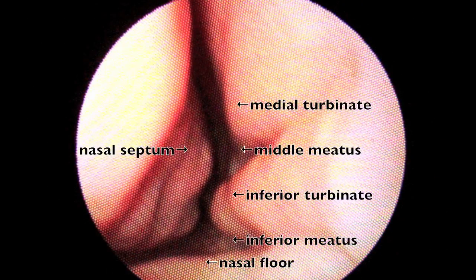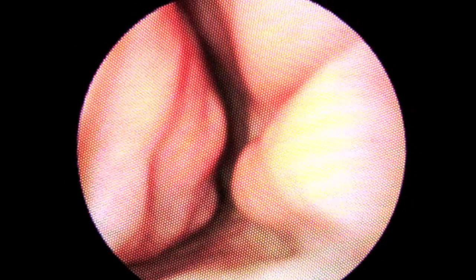I am passing the endoscope through the patient's right naris. On the left, you will notice the nasal septum. On the right, you will observe the turbinates as we progress through the inferior meatus, just above the nasal floor.